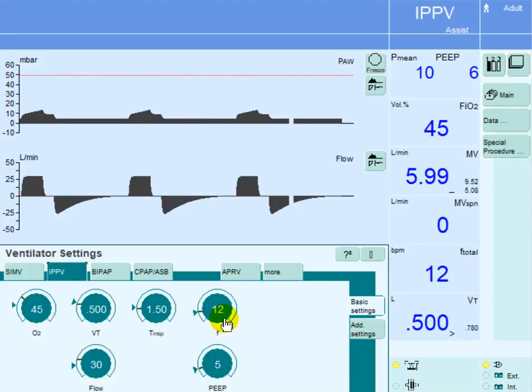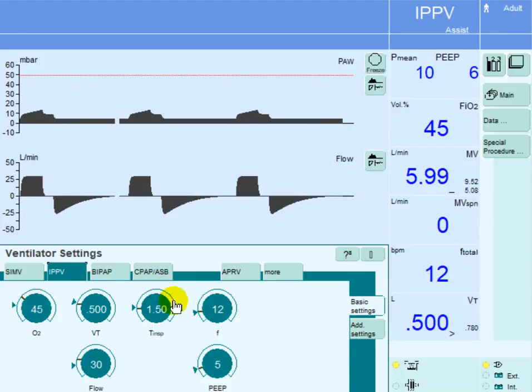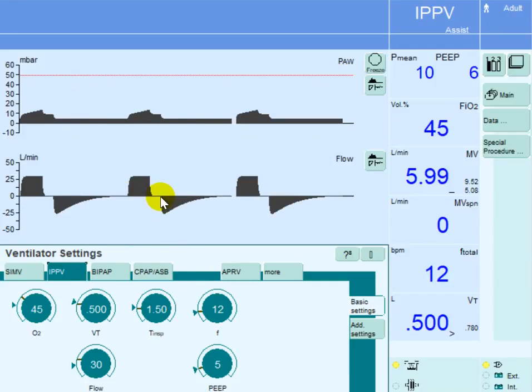The trigger here is time, which is set at five seconds. The inspiratory time is set at 1.5 seconds, indicating that the whole inspiratory time will be 1.5 seconds.